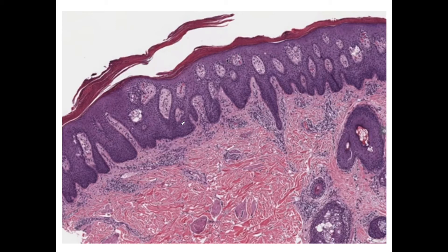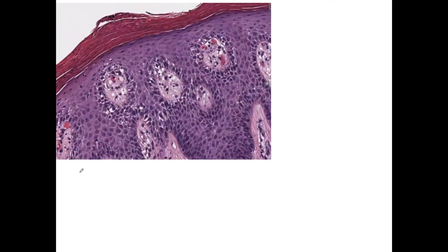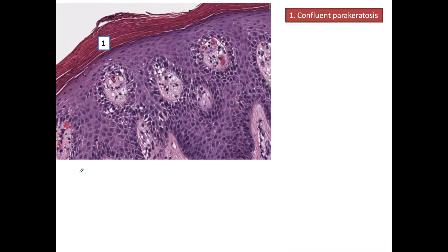Coming to the histopathology — this is the H&E stained slide of the lesion where we can see the changes in the epidermis. We see acanthosis of the epidermis along with elongation of the rete ridges. Starting from the stratum corneum, we can see confluent parakeratosis. Parakeratosis is defined as presence of nucleated keratinocytes in the stratum corneum, believed to be due to accelerated turnover of keratinocytes.